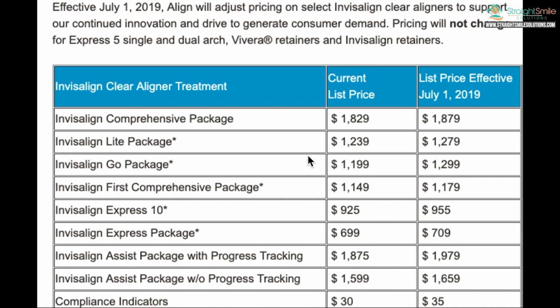Again, I just want to clarify, because sometimes people get a little upset. I'm a big fan of Invisalign. It is for sure the most premium product out there for aligners. It is the best for a complex case. For an easy, mild to moderate case, lots of options. So it's all how it works in your hands. You have to have the skill set in order to make that treatment plan optimized.